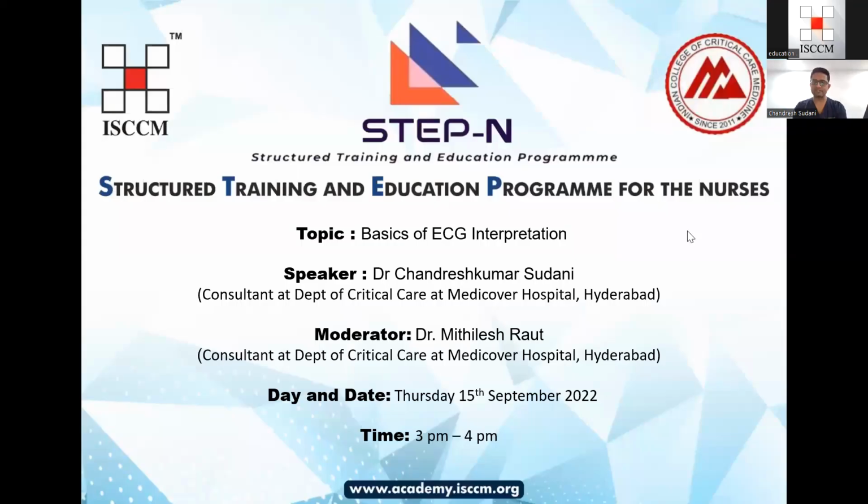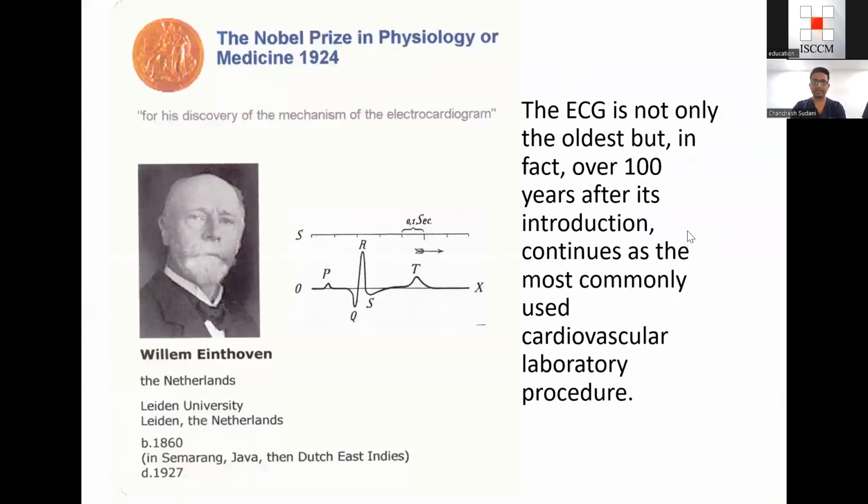The topic is very interesting: basics of ECG interpretation. This is the most common investigation we see as far as cardiology is concerned. And if you look at the history, the ECG is one of the oldest investigations, which has been there for the last 100 years, and still it continues to be the most important investigation for the cardiologist.